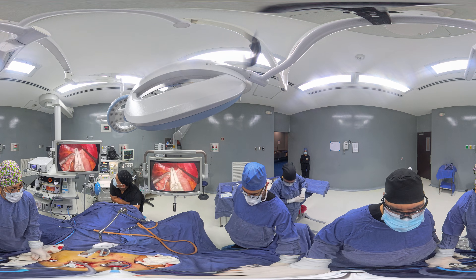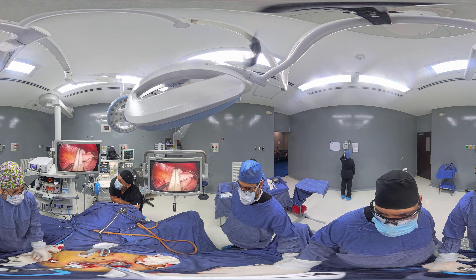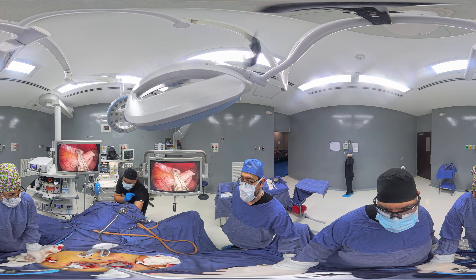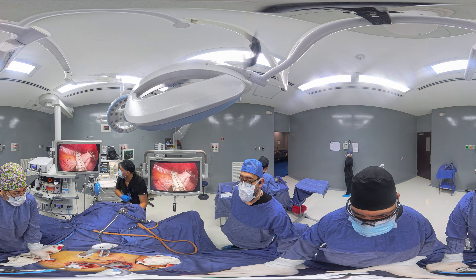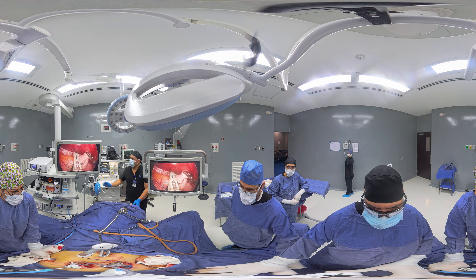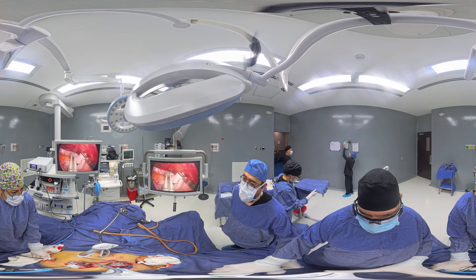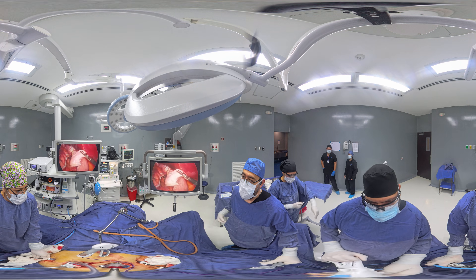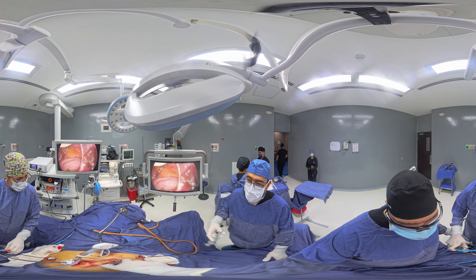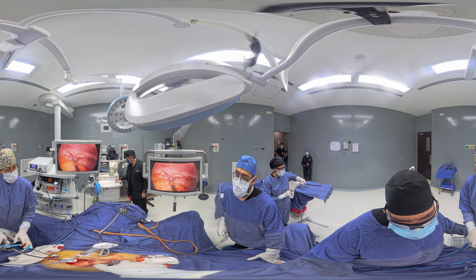This is the last load. Every time I close the stapler, make sure the bougie is moved — make sure we're not grasping the bougie. At this point, that's the sleeve. Many surgeons leave the sleeve as is at this point and finish the procedure, which is okay.